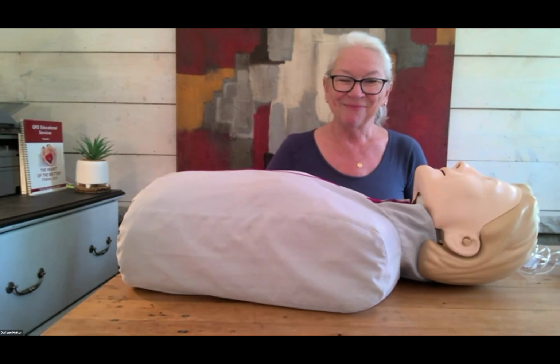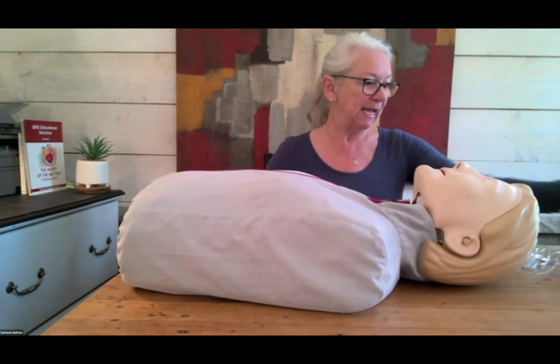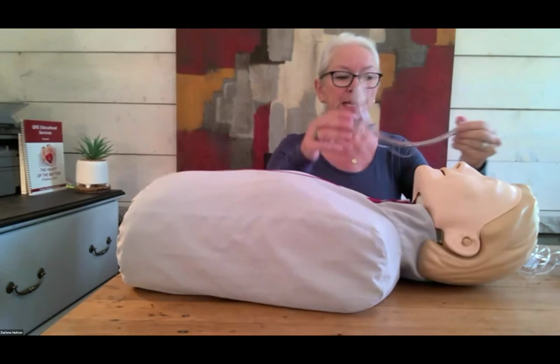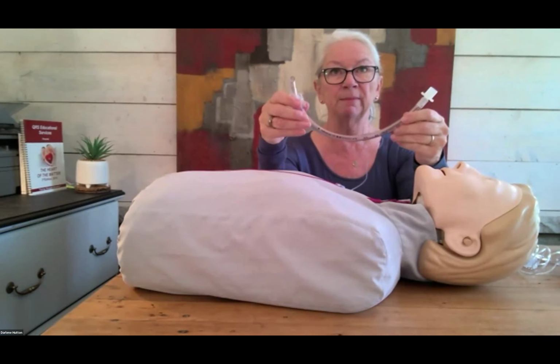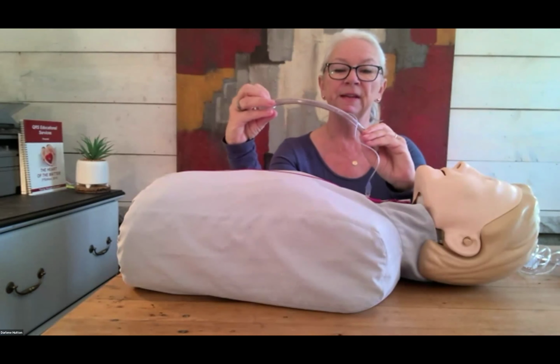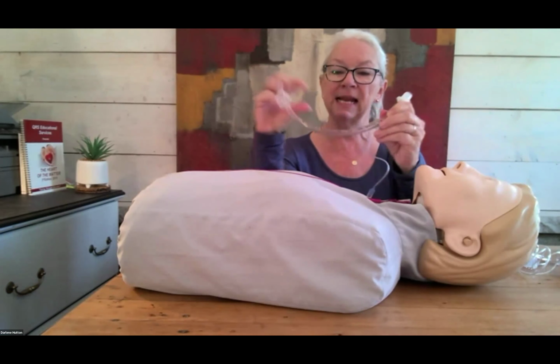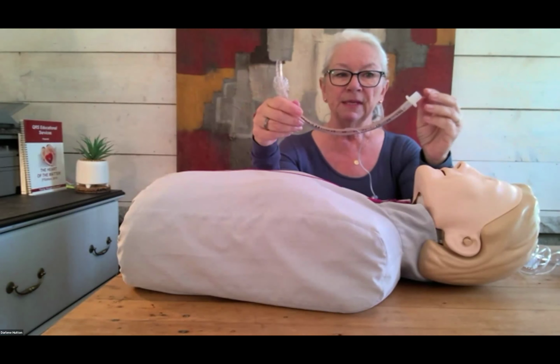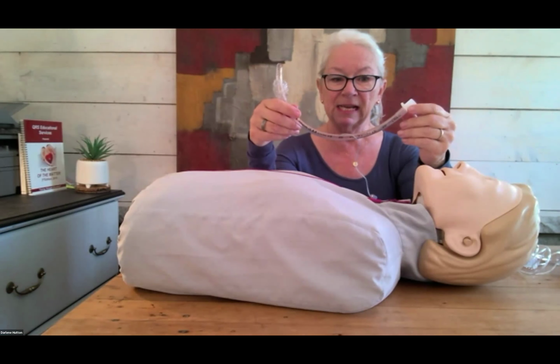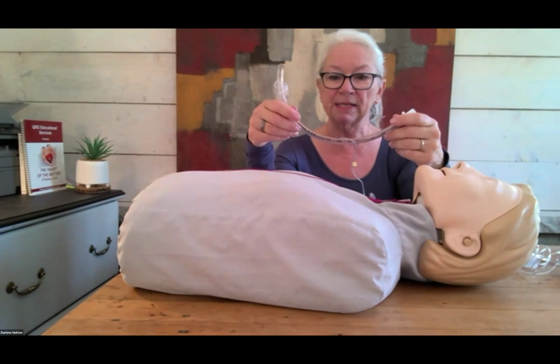Let's look at the E now. There are 2 E's, the endotracheal tube. And for an adult, most sizes will range from 7 to 8.5. This one here is an 8.0. The decision will be made by the physician, and they may ask you to get the appropriate size.